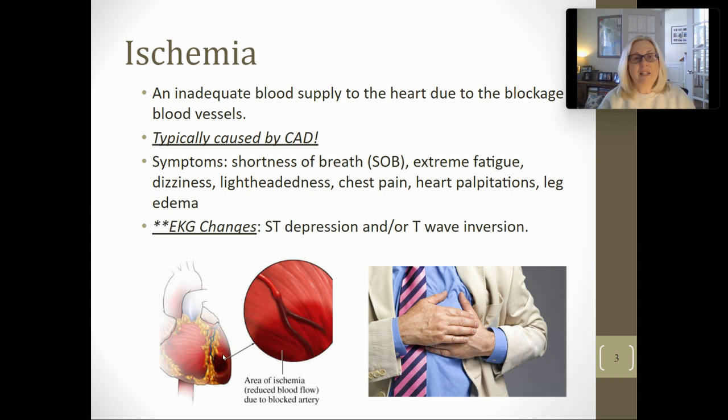So we have this patient that comes in, say the emergency department, and they have all these symptoms, and I want to go like, is it a heart attack or is it just ischemia? So we're going to hook them up to an EKG, and then I'm going to notice on the EKG if there's what's called ST depression or T wave inversion, and I'll think about it for a second what that means and I'll explain it. But ST depression or T wave inversion, those are the two things right away that we can determine if they have ischemia, narrowing of the blood vessels in that area of the heart.